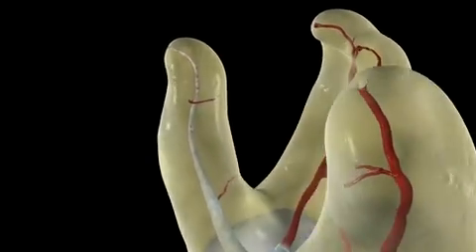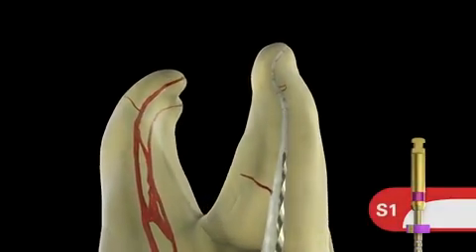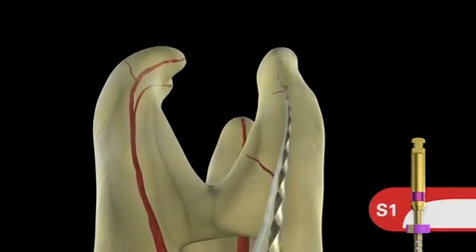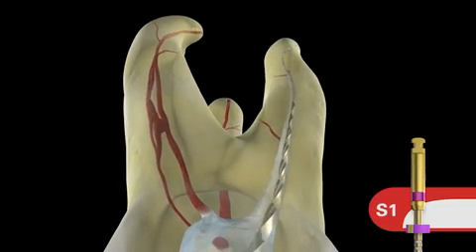Look at this anatomy. Isn't this fun? Well, let's get back to our shaping files. And obviously, the first one in the series is the purple stripe. Shaper 1 has never been to length. Shaper 1 is used like a brush.